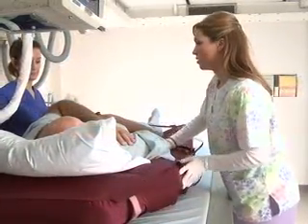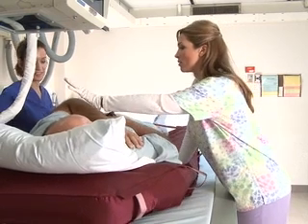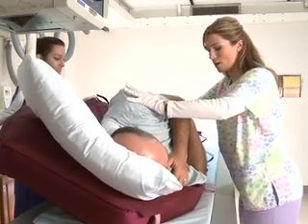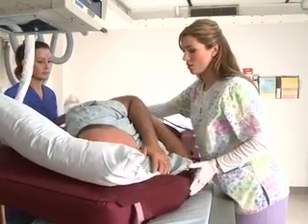The caregiver on the turning side will then place one hand on the inflated HoverMatt by the patient's upper torso, as close to the body as possible. The other hand should be raised in preparation to stop the patient's upper body from over-rotating once he or she has reached the desired side positioning. The caregiver on the turning side then initiates the turn by pressing down one hand on the HoverMatt, while instructing the caregiver opposite the turn to simultaneously pull up on the HoverMatt using the handles.